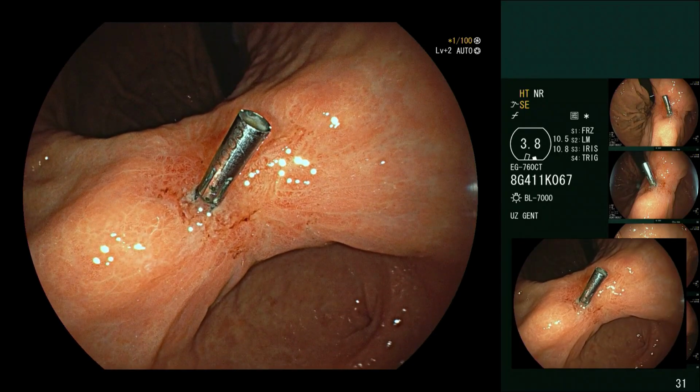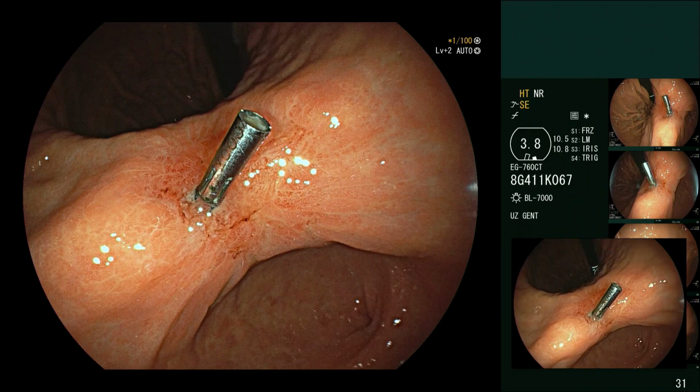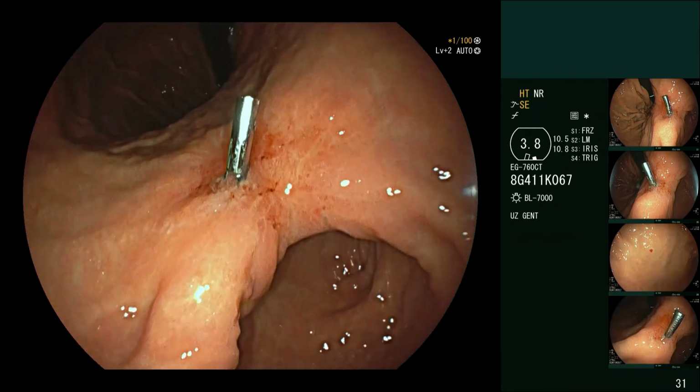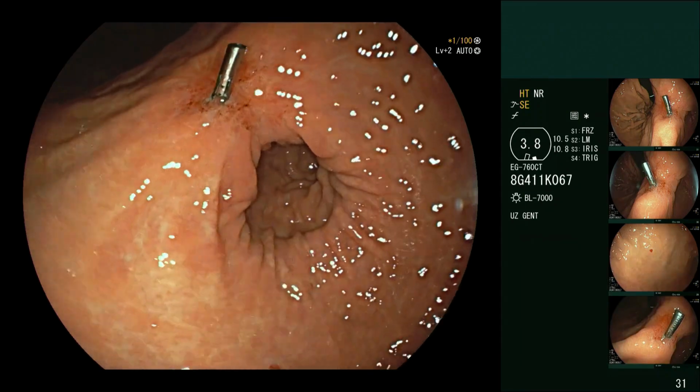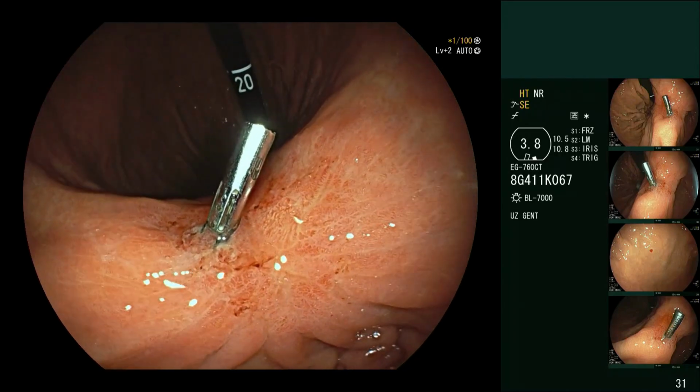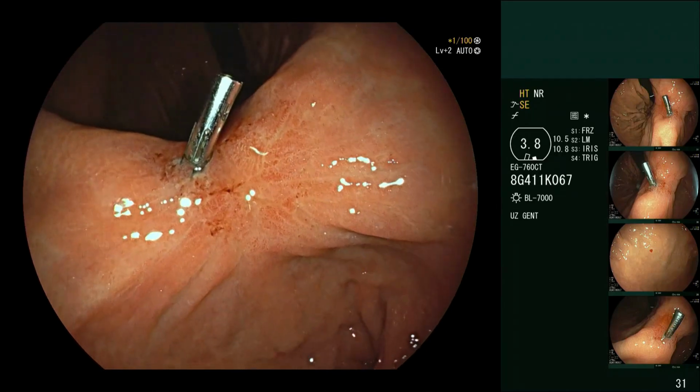If you go and look at the upper GI course, I think maybe the second day, you'll find this lesion there and how we characterize it. But it was on the angulus, on the incisura. And this goes to highlight that these are very difficult to see. We spent a lot of time looking before we saw this lesion, and this patient had a lot of endoscopy before this lesion was detected.